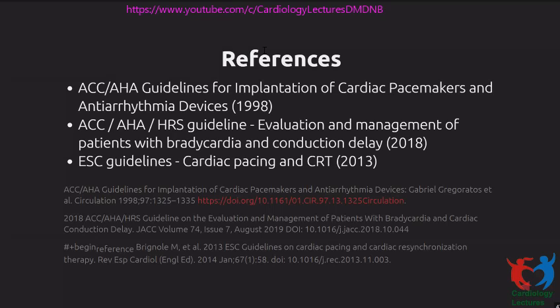So like I said, first is what do you label this patient? Because of the different kinds of terminology that are there, I suggest that you always call these patients by exactly what you see. I would call this patient LBBB with a prolonged PR interval. But in terms of terminology, you can sometimes call this bilateral bundle branch block. You can call this a trifascicular block also, because a left bundle branch block implies block of left anterior and posterior fascicles, and a prolonged PR interval in this setting implies disease of the right bundle also. So you're going to essentially take it like a trifascicular block.